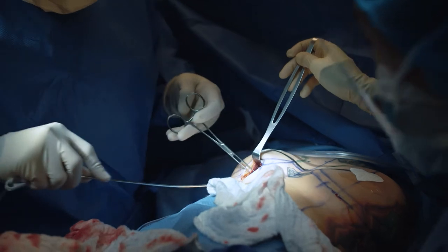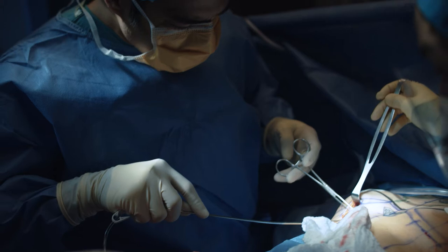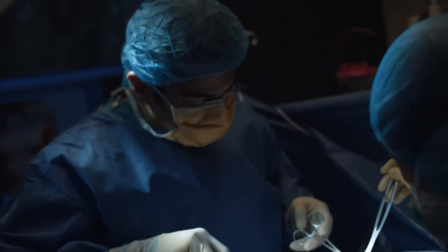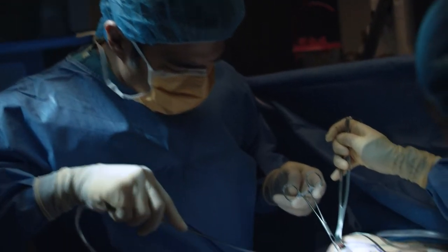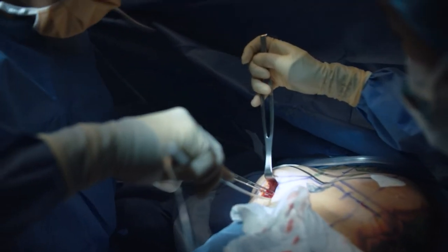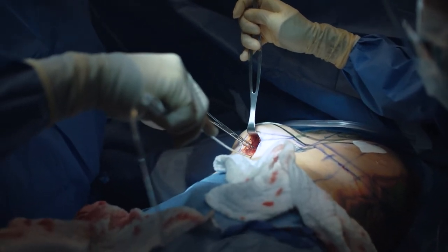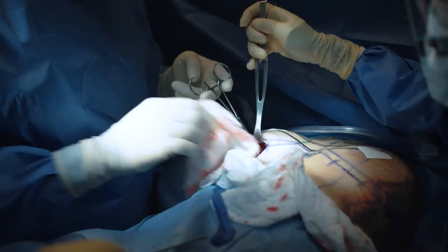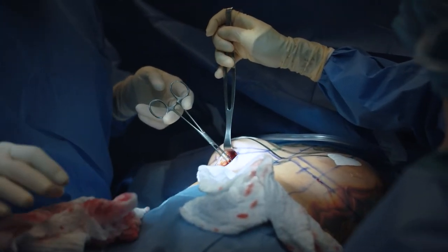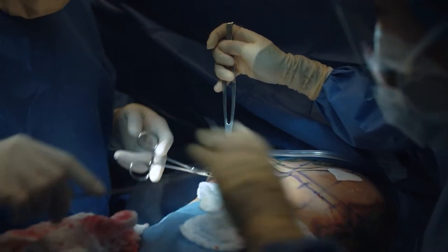possible to do. Now, below the muscle, I'm going to put my numbing solution to help create the pocket, decrease bleeding and bruising. Now, I also put some anti-pain medicine in this, and that decreases the patient's postoperative pain. Okay? Then we're going to wait 30 seconds. Let that sit there.